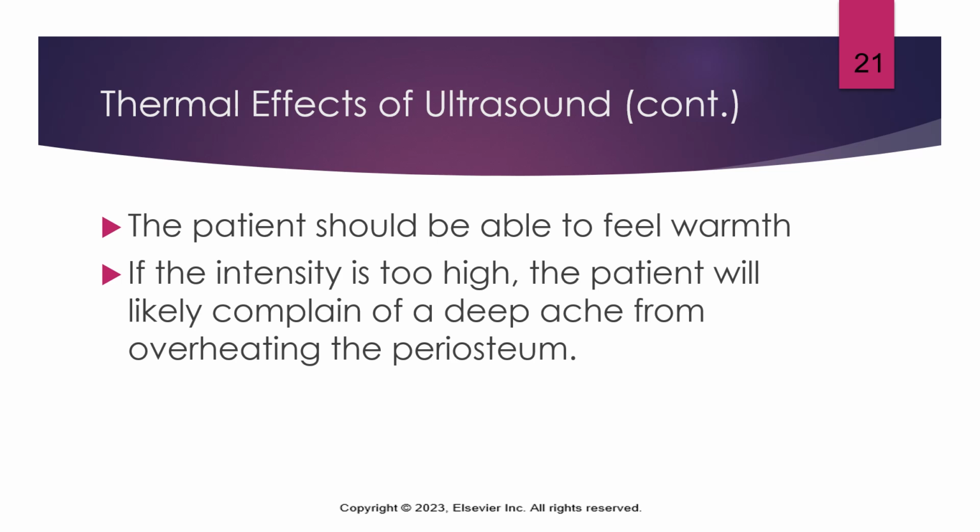I like to keep that off because I want them to actually be able to tell me if that ultrasound head is warming up due to this reflection or refraction that's occurring. I want them to be able to sense the heat without introducing it beforehand. So I typically leave that head warmer off. I just want them to feel the actual warmth from the head of the transducer.